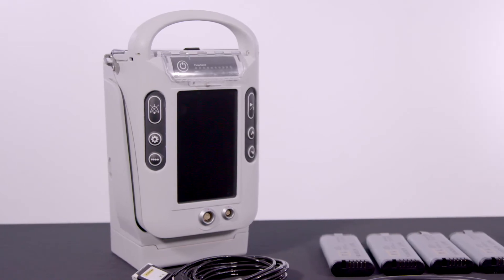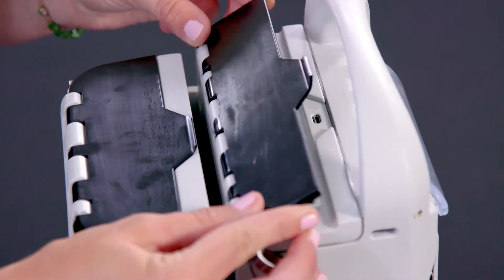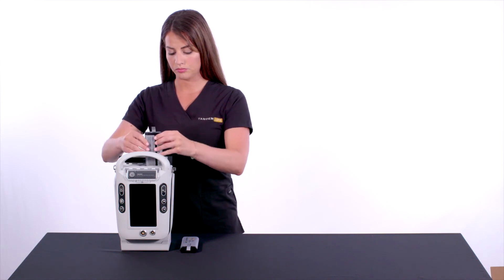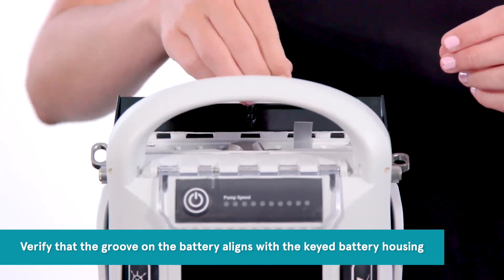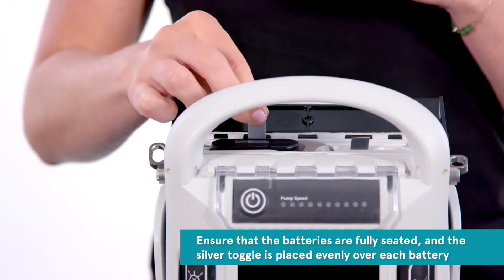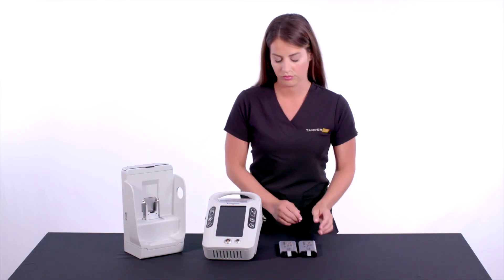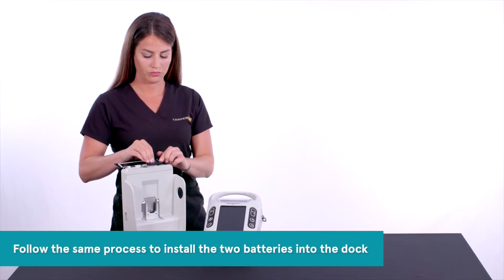The first step in setting up your LifeSpark controller is to insert two batteries into the controller. Open the battery door on the controller, then insert each battery with the logo facing away from the controller's main screen. Verify that the groove on the battery aligns with the keyed battery housing. Ensure that the batteries are fully seated and the silver toggle is placed evenly over each battery. Additional batteries may be purchased separately for backup. Follow the same process to install the two batteries into the dock.